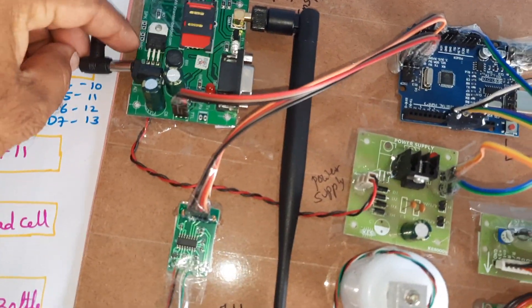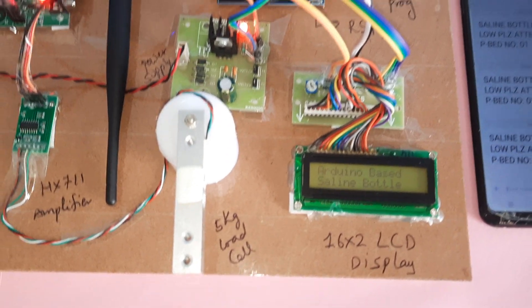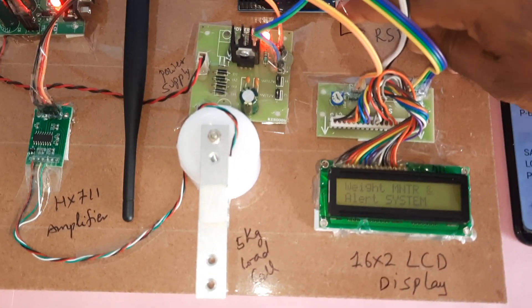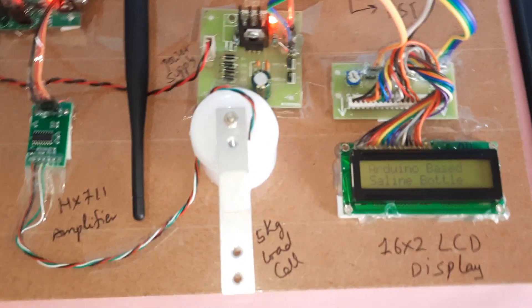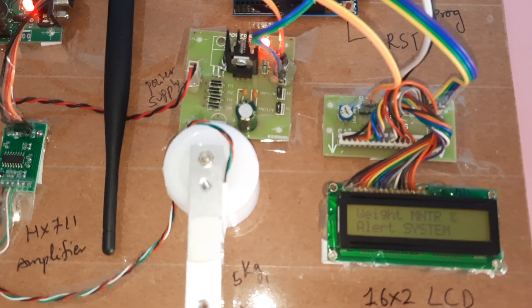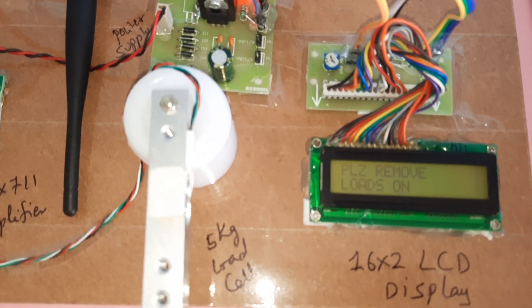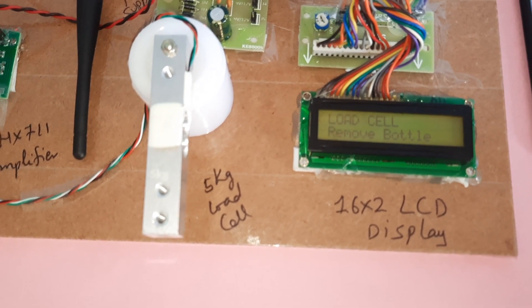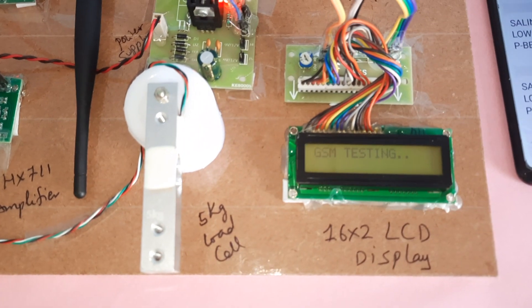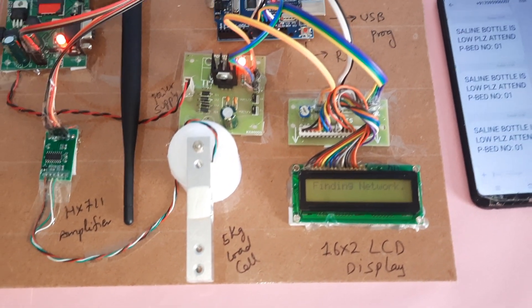Now I am giving the power supply. It restarts — Arduino-based. The LCD shows: 'Saline Bottle — please remove the loads on load cell.' GSM testing: connected, finding network.